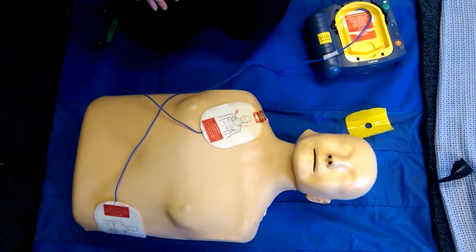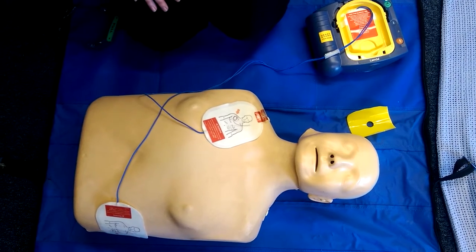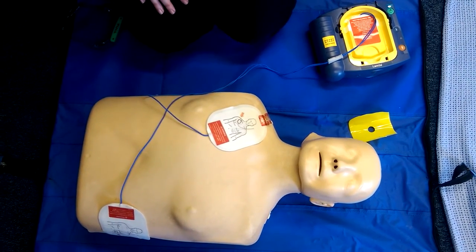'Shock delivered. Be sure the ambulance service has been called.' And that's as simple as it is — you can now touch the patient and you can do CPR.